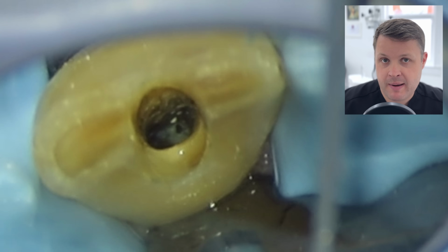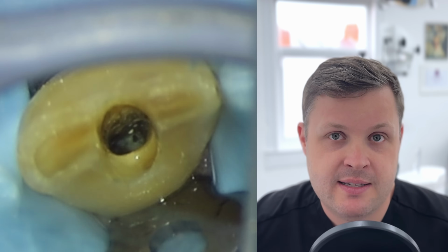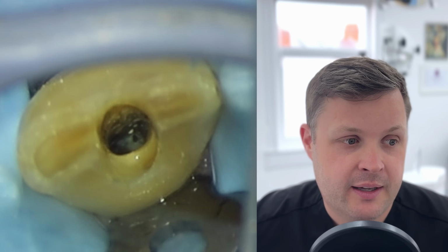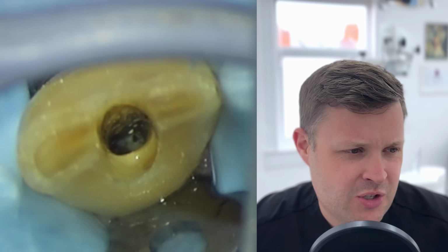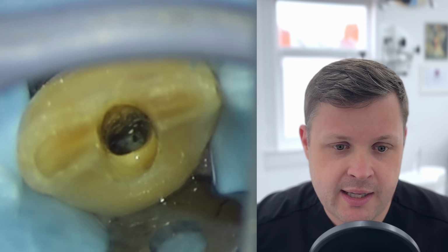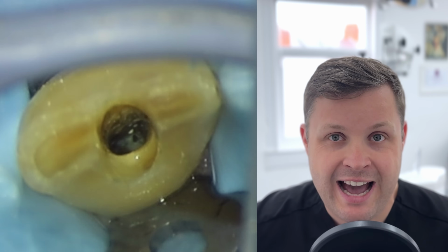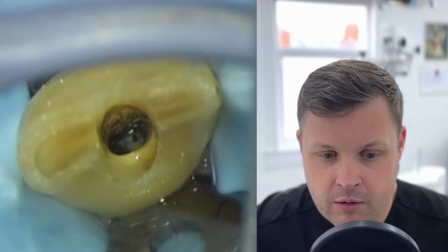This is the great thing about non-setting calcium hydroxide. It obviously acts as an antibacterial, but it also cleans up, and sometimes I want to say dissolves dentin, but it doesn't dissolve dentin. Essentially, it just cleans the inside of the root canal up. What's essentially happened here is I've soaked this tooth in non-setting calcium hydroxide, I've cleaned it all out, and this has exposed a possible canal orifice.